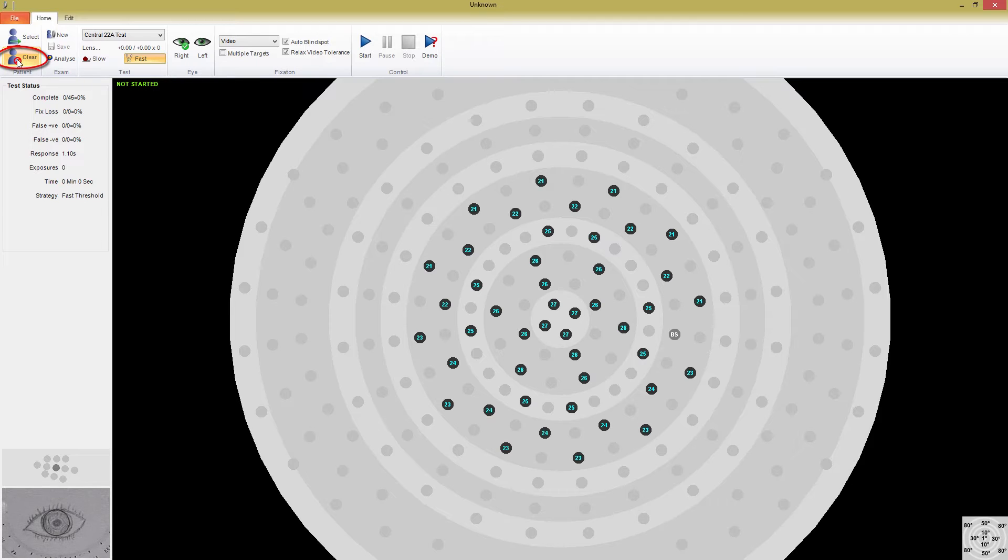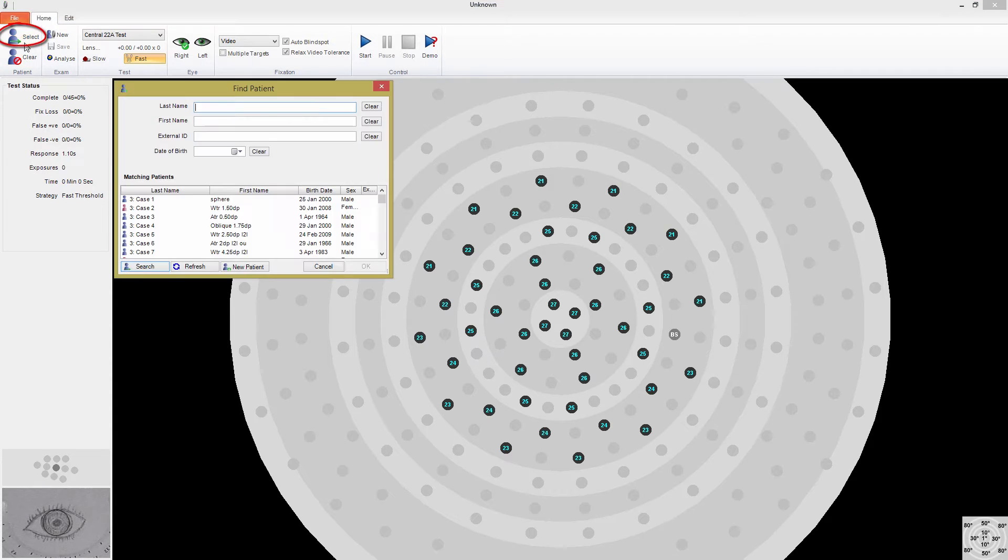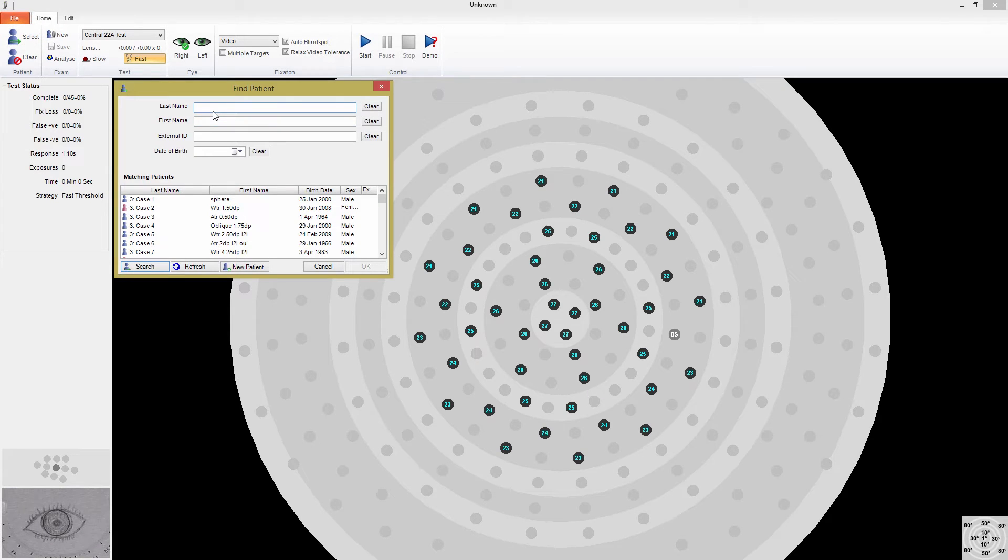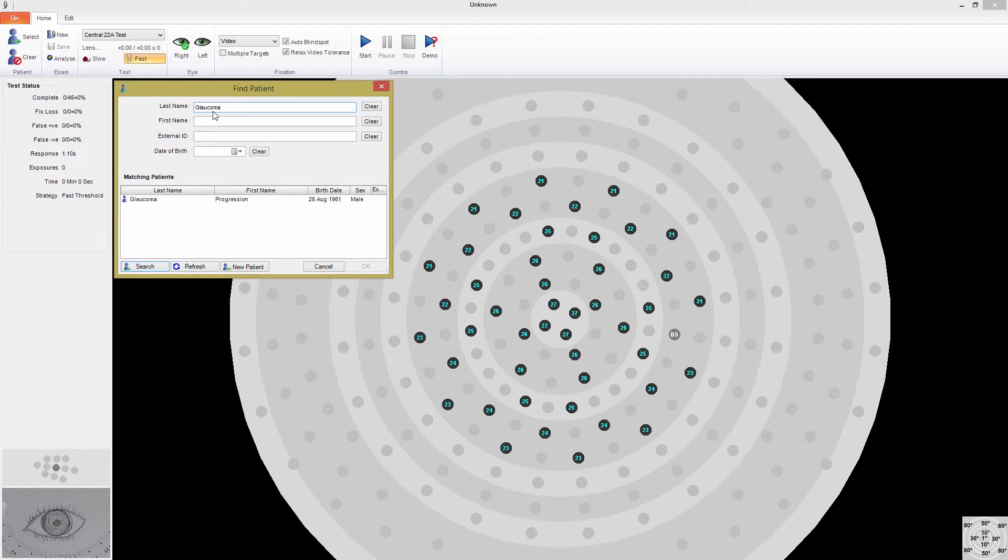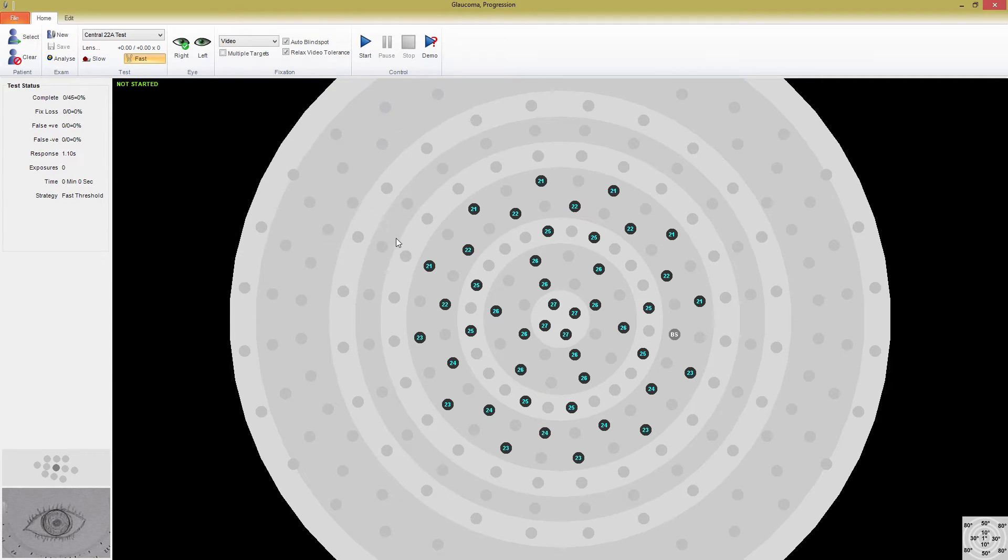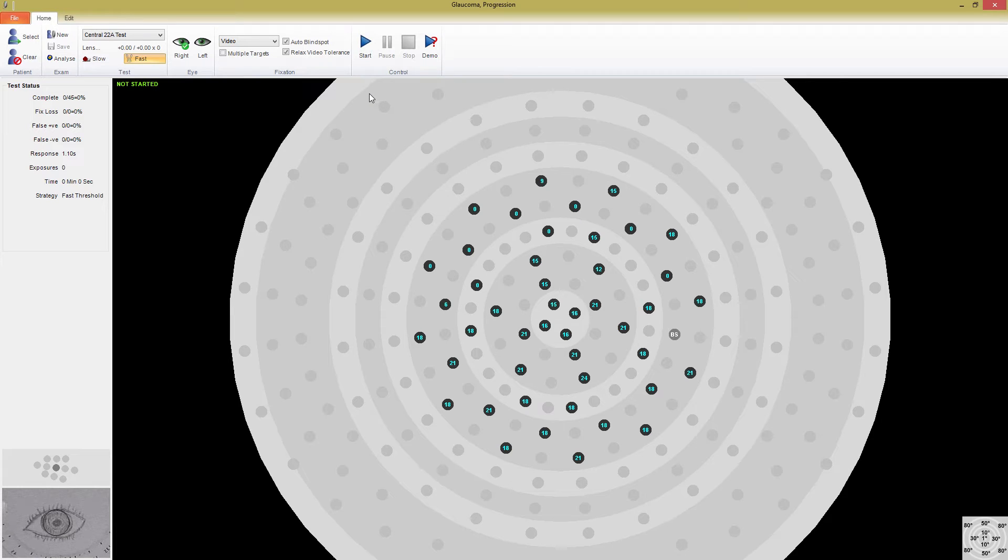You can also select a different patient by pressing Select, and either typing in a name or choosing a patient from the list. An important feature, if you're quickly screening patients and you don't necessarily need the test associated with the patient, is that you can leave the patient field blank and still run a test.